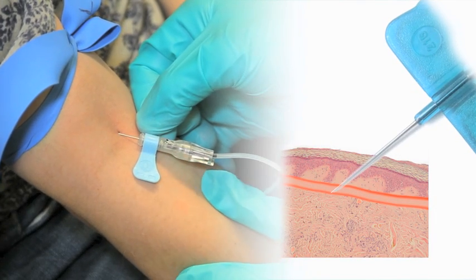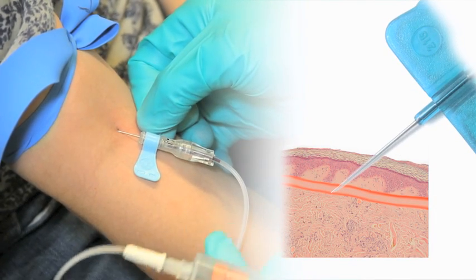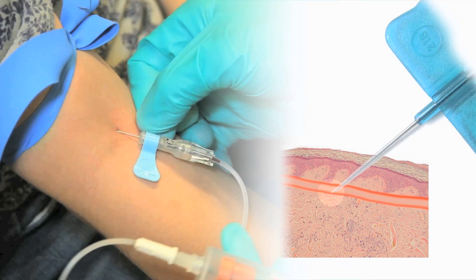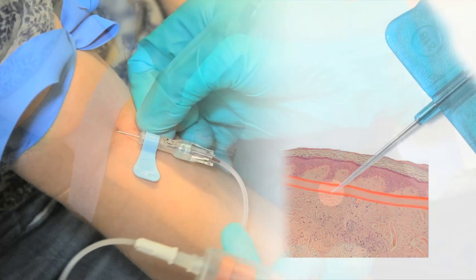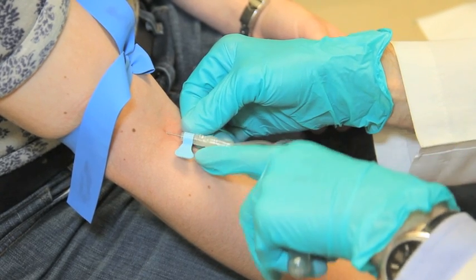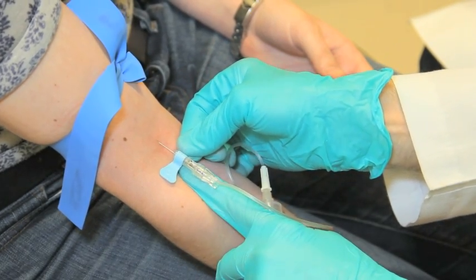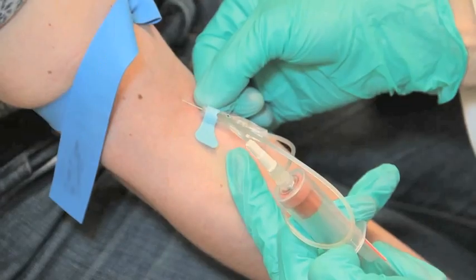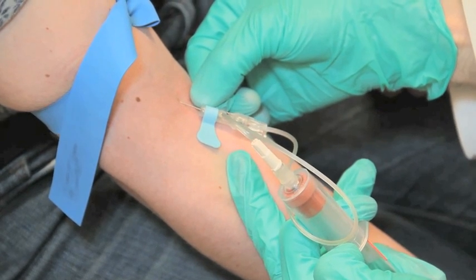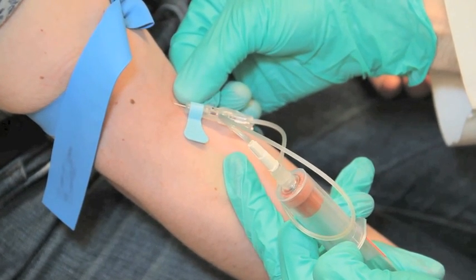If a flash of blood was seen, but there is no flow after piercing the seal of the vacutainer, the vein wall may be occluding the opening of the needle. By retracting the vein with your left index finger, the bore of the needle will be redirected into the lumen of the vessel and allow blood to flow. If necessary, carefully readjust the needle one or two millimeters either out or in to start blood flow.